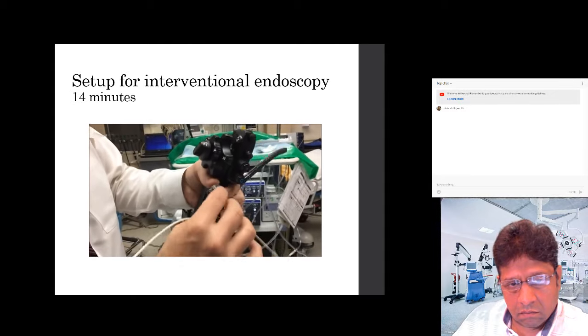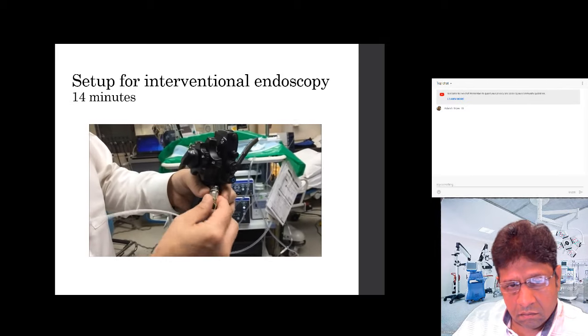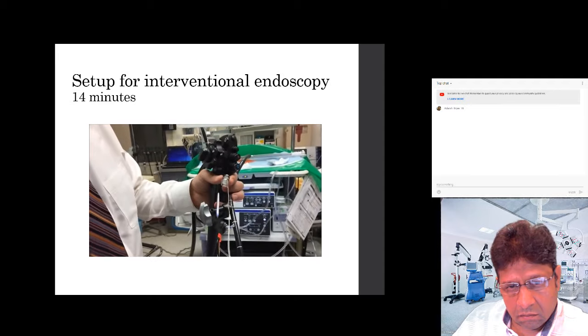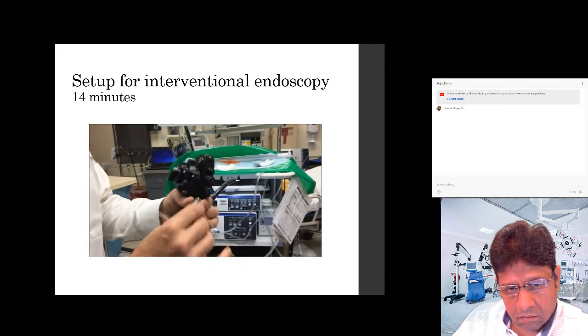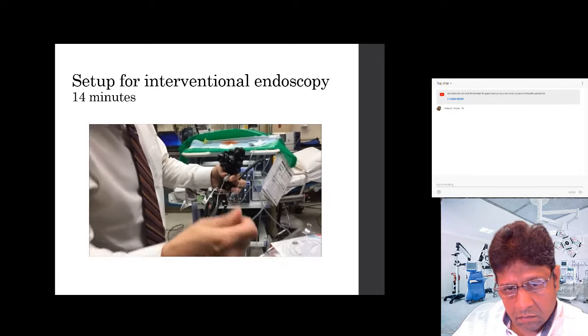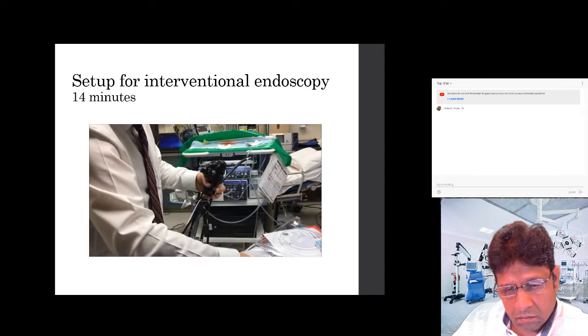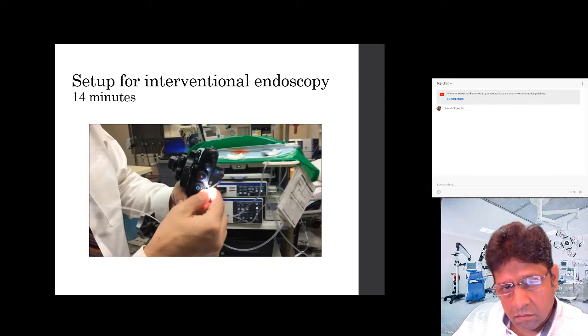I think this one's already been opened because we kind of used it to show how it works, but let me see, make sure I'm doing this one correctly too, because it looks like it's a little tampered with. Okay. So what we do then is we take this end here. Where's the other end? Here we go. Let me just put this end down for a minute. And then basically, as you can see, there's a little knot on the end.